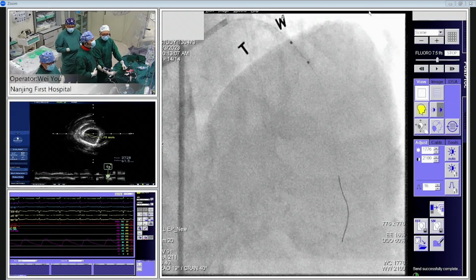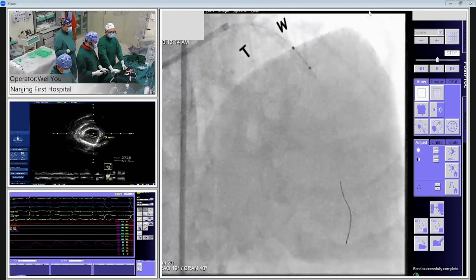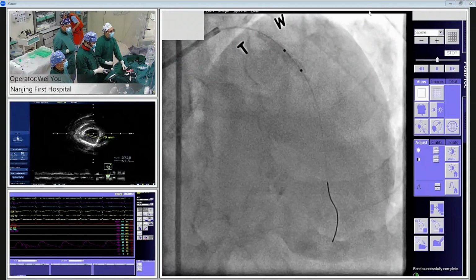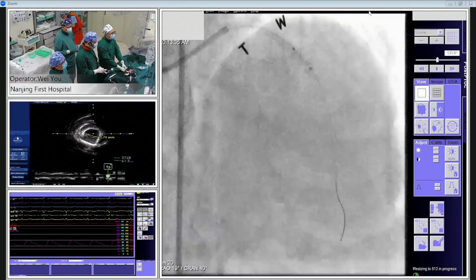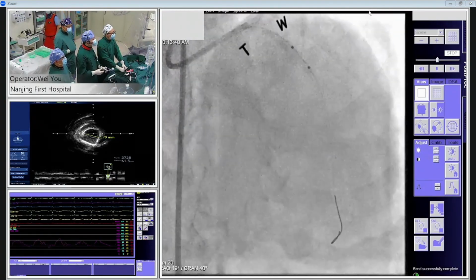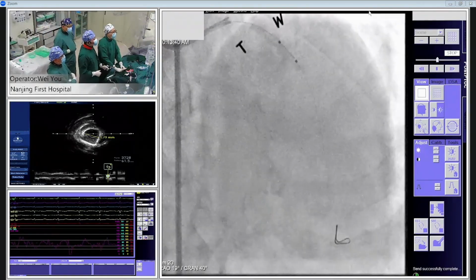So actually we have started shock with this IVL device. The first round, we go up to 4 atmospheres. Okay, going up to 6. Now it's the second round. We're up to 6 atmospheres, fully inflating the shockwave balloon. Retrieve, please. Okay, Chief, I will retrieve the balloon for the middle segment, pulling back the balloon to the more proximal side.